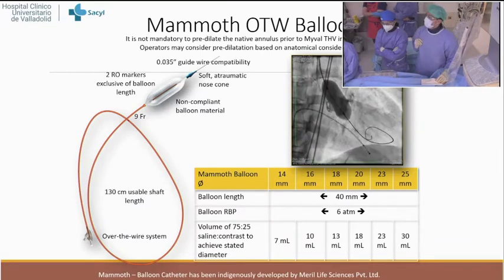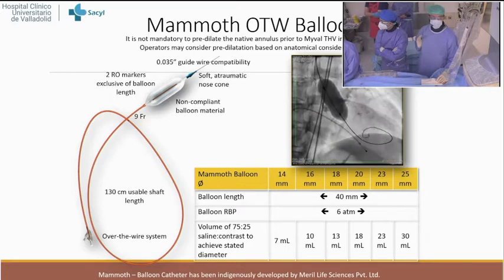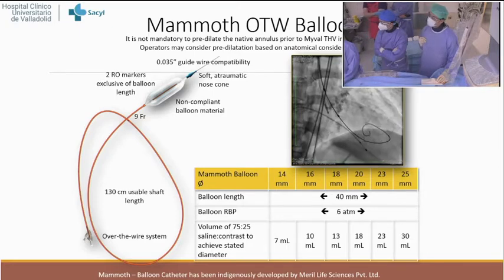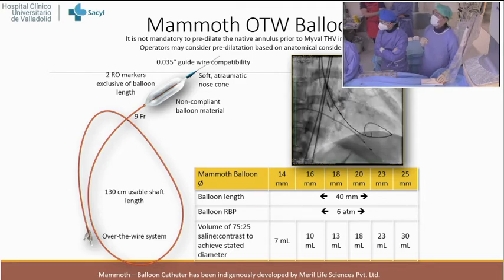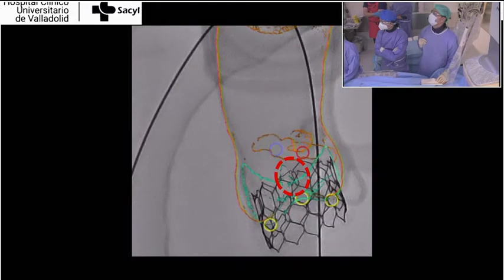And finally, we are going to predilate. We had relatively abandoned predilatation, but we are redoing predilatation now in more and more cases, about 20% of our cases. In this case, we are going to predilate due to severe calcification. This is the Mammoth balloon, with excellent navigability. Next slide.